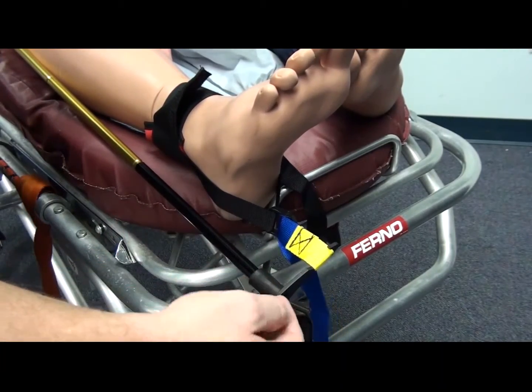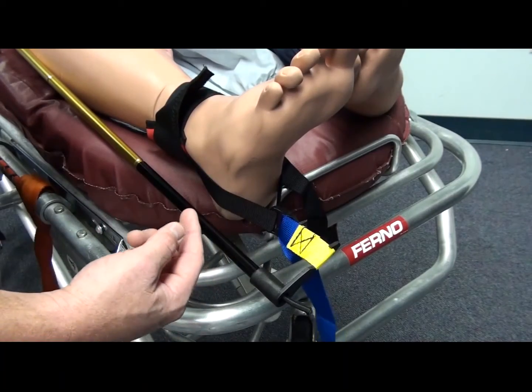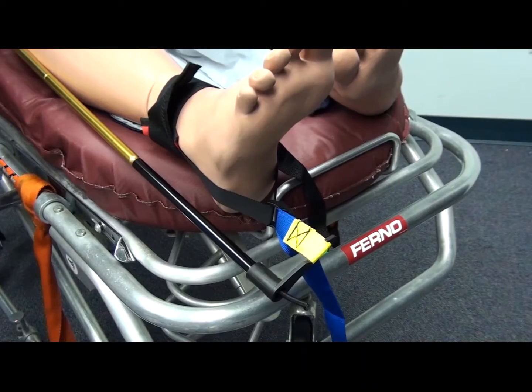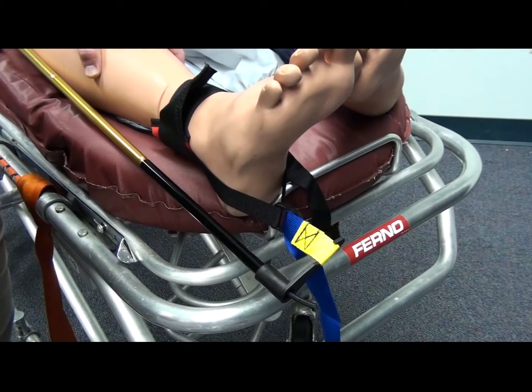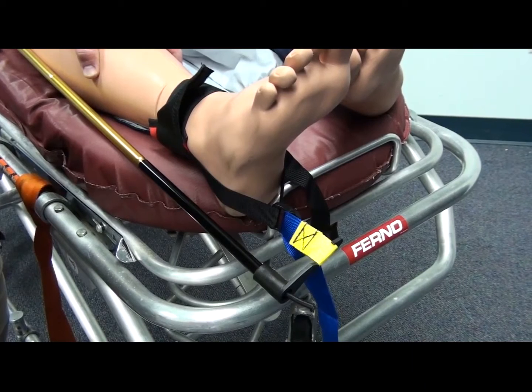Now, if you do not have this pole extended far enough, you will run out of strap and you'll have to reposition the pole. So you would have to come to the Ischial strap, extend the pole, place it back into the Ischial strap, and then readjust your ankle hitch. For this, it works well at the position it is.